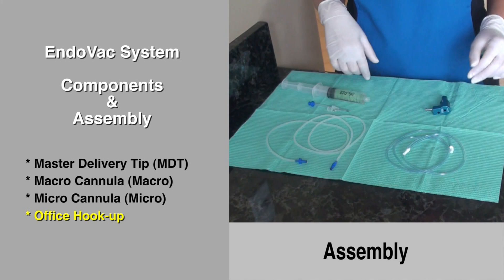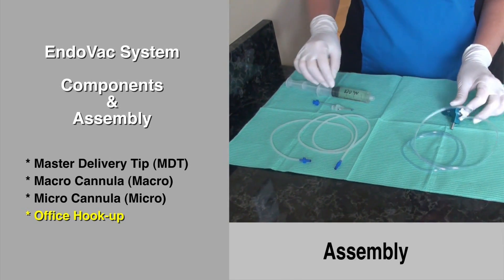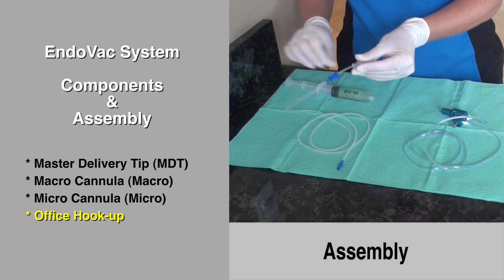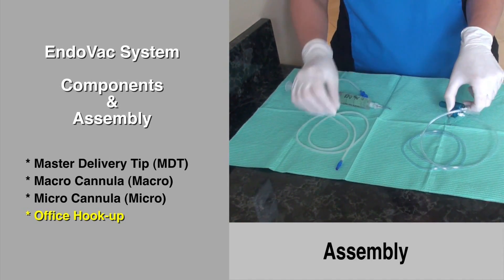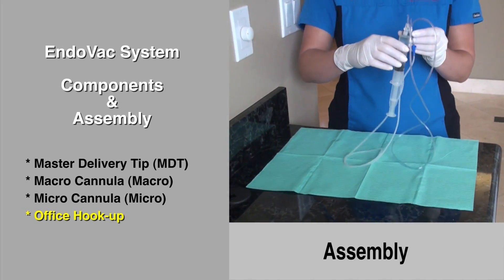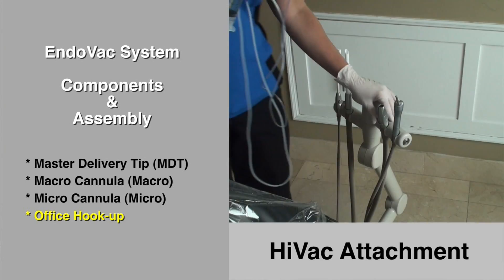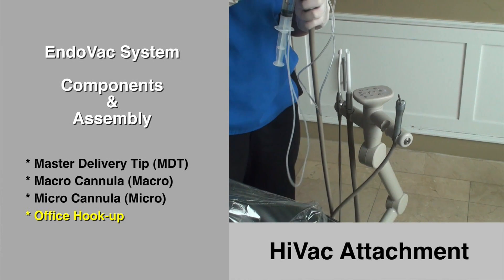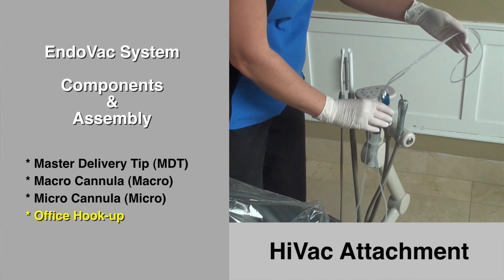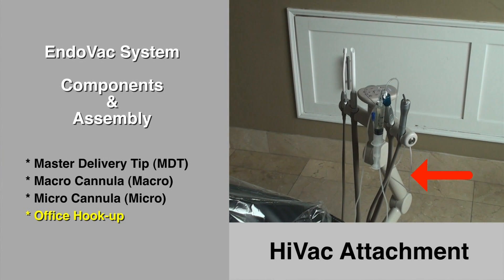The Endovac system is easily assembled using the multiport adapter to conveniently hold the system together at chairside. First, the assistant plugs the two white fittings in the holes on top of the adapter. Next, one of the blue fittings on the silicone tube is attached to the master delivery tip, which is then attached to a 20cc syringe, and the other blue fitting is plugged into the multiport adapter. The master delivery tip is then hung on the multiport adapter, which is then inserted into the office hivac. It is very important to hang the clear tubes behind the rack because this tubing will not be used until after instrumentation, avoiding any tangling with the silicone tubing used frequently during instrumentation.